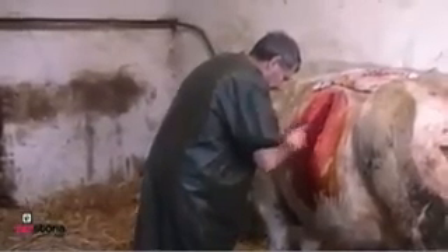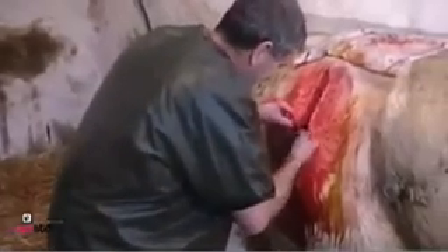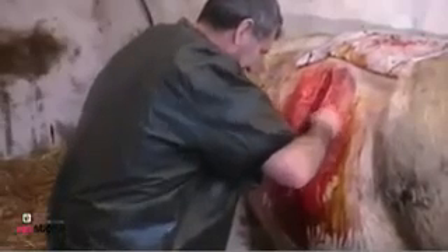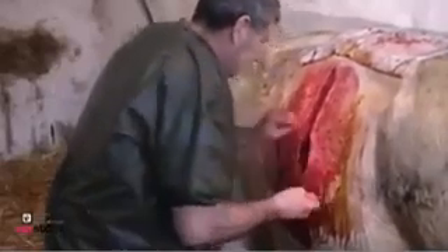The muscles also get sutured back together again in two separate layers. Here we can see the vet stitching the first layer, and here we can see him stitching the second layer. Finally, the skin is closed with a single layer of stitches.